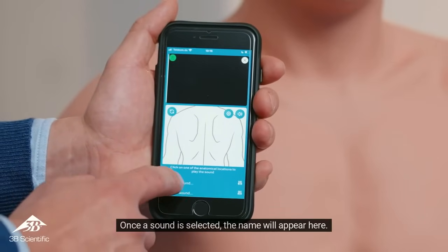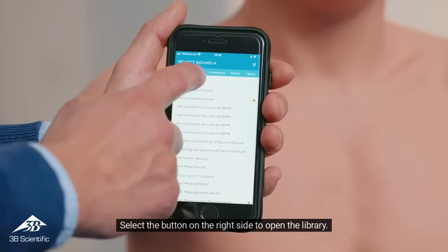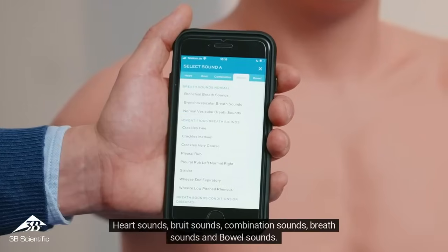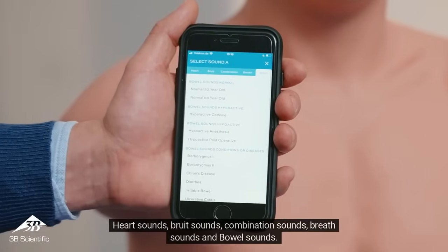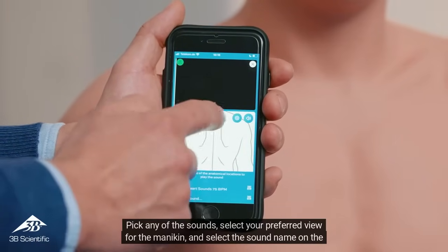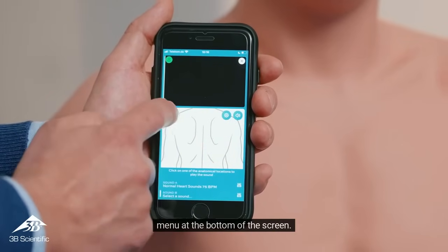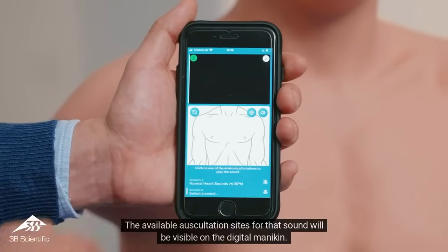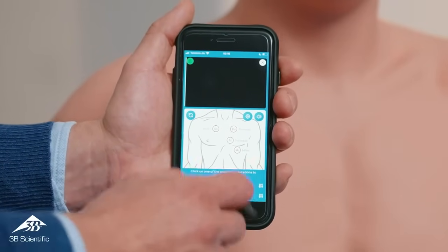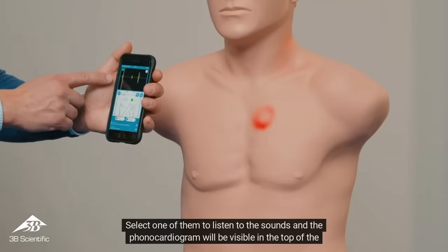Once a sound is selected, the name will appear on screen. Select the button on the right side to open the library. You will see the sounds are separated into categories: heart sounds, bruit sounds, combination sounds, breath sounds, and bowel sounds. Pick any of the sounds, select your preferred view for the mannequin, and select the sound name on the menu at the bottom of the screen. The available auscultation sites for that sound will be visible on the digital mannequin. Select one of them to listen to the sound, and the phonocardiogram will be visible at the top of the screen.